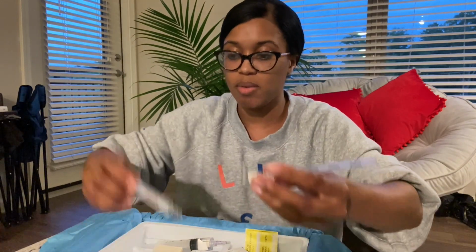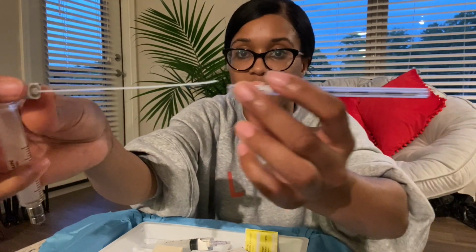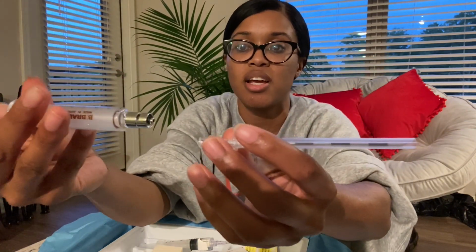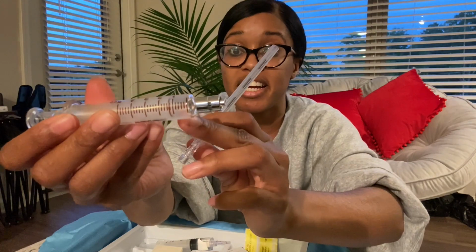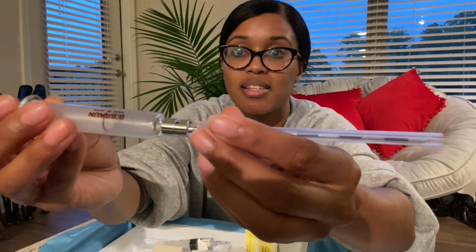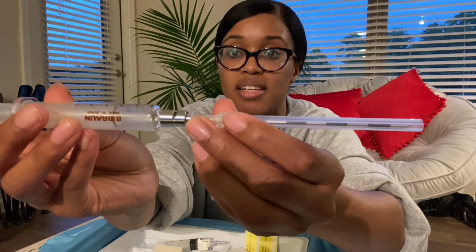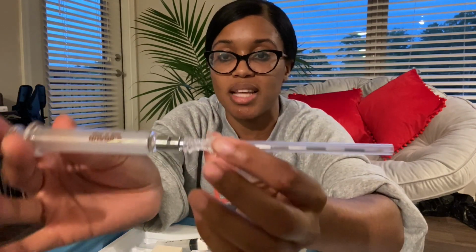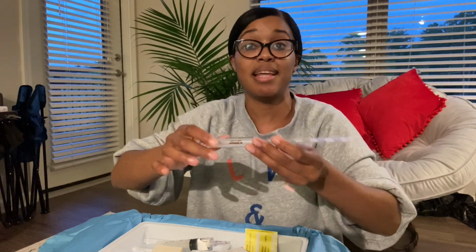So basically, the loss of resistance syringe, and this is just like a stylet inside the epidural needle. But the loss of resistance syringe, we can either put air in here or we can use saline. When we're attempting to put in the epidural, we'll hook this up and test loss of resistance. And once we get a loss of resistance, it will just be like this. That pretty much means you're in the epidural space. And there's always a possibility that you're not. Sometimes there's such a thing as a false loss of resistance, but I won't go into all that. But basically we test for loss of resistance.